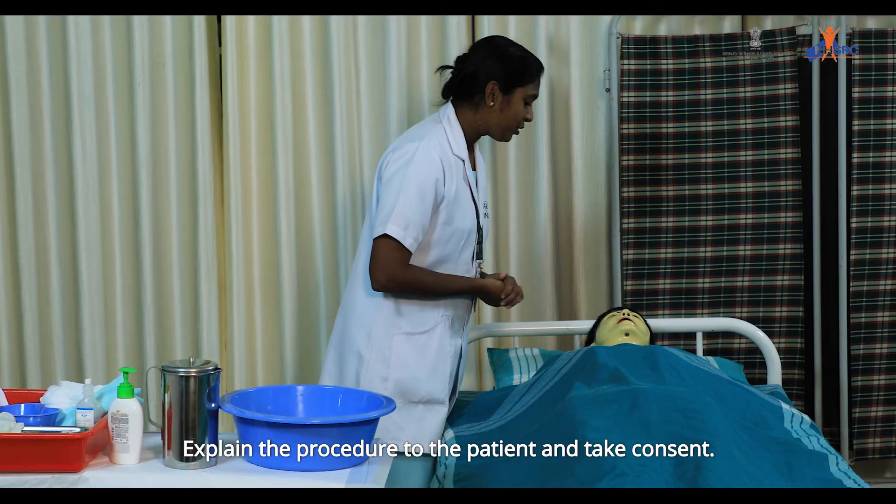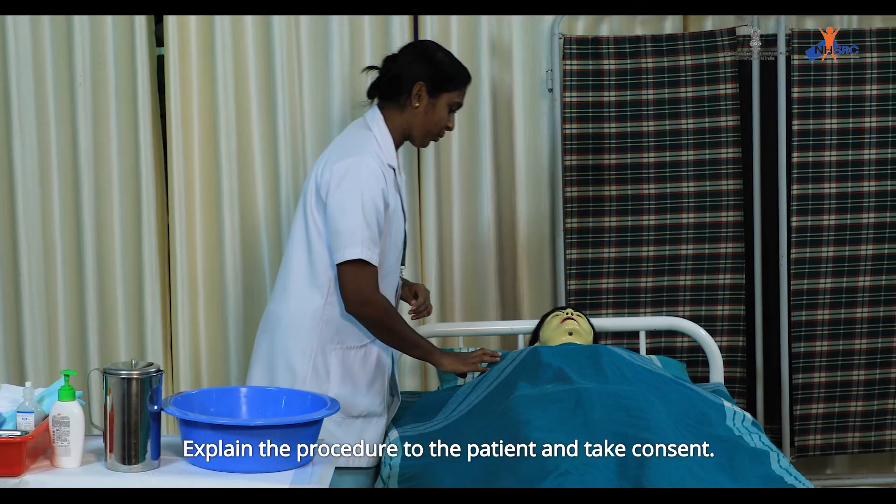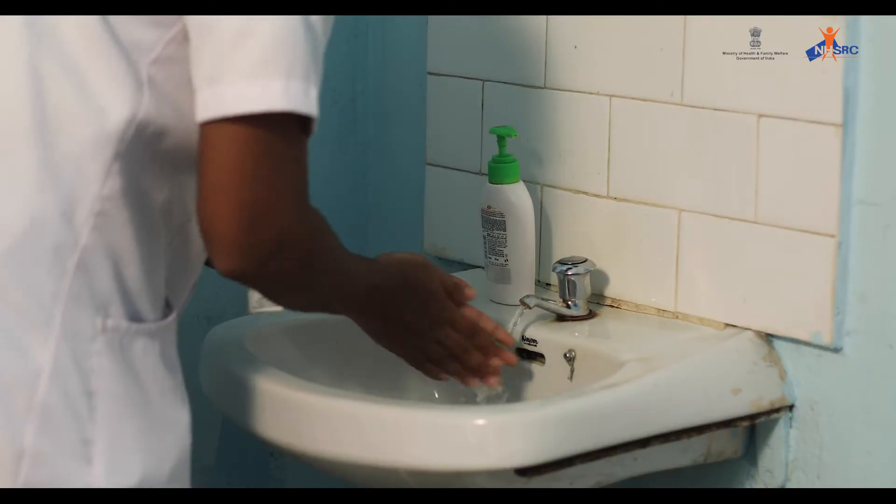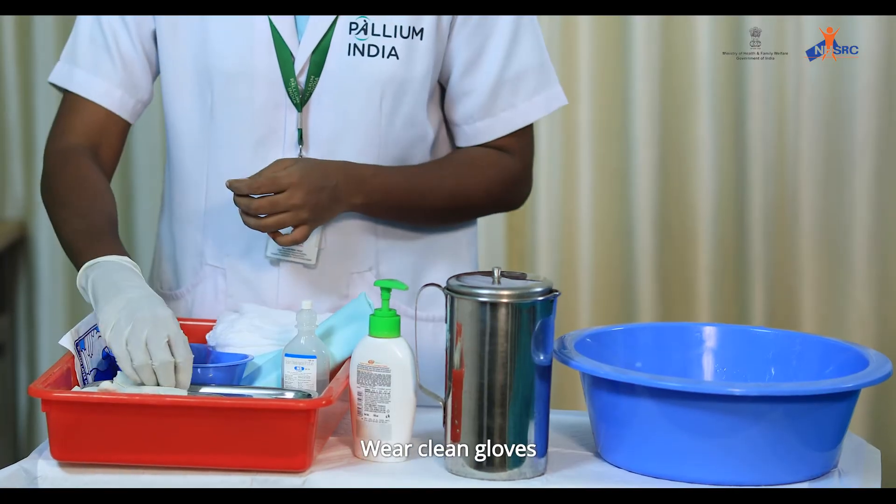Greet the patient. Explain the procedure to the patient and take consent. Provide privacy to the patient. Wash hands. Wear clean gloves.